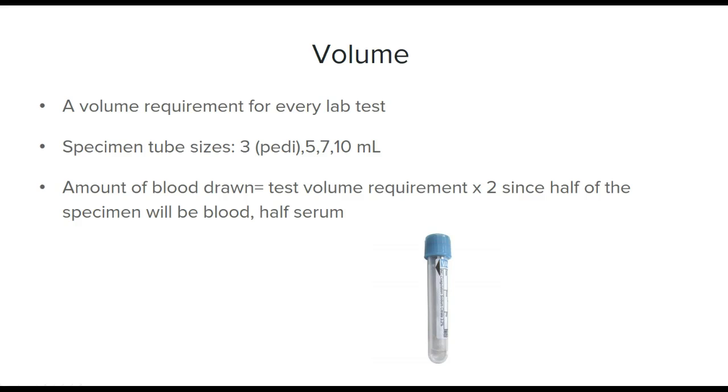Okay, volume. Before you stick, you need to make sure you know what tubes you need to get and how much you need to get in each of those tubes. Every test has a certain volume that we need in order to do the test, and you need to make sure that you get enough.